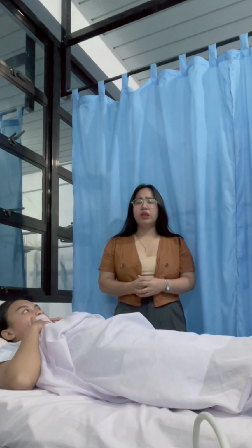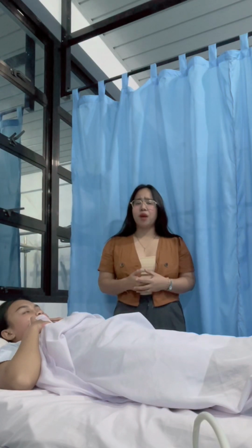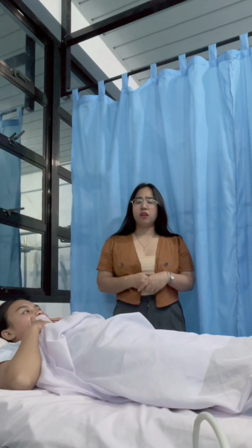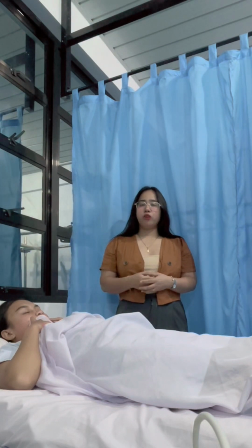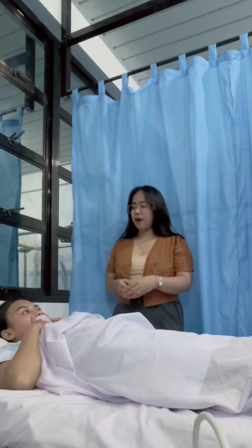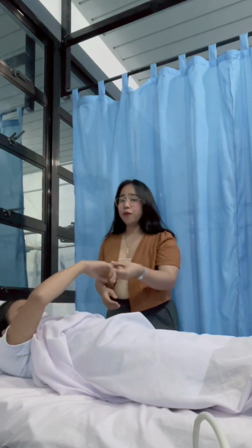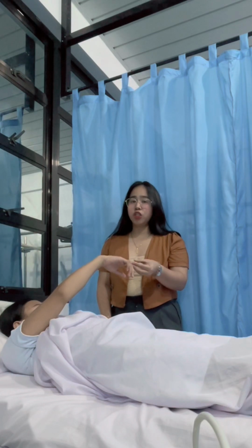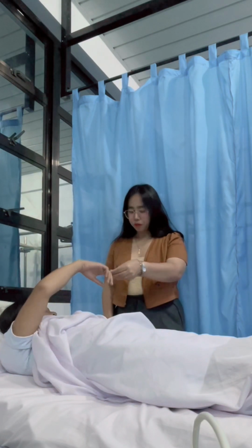But we need to make sure that the patient doesn't notice that we count his or her respiration, for her to feel comfortable and not conscious. And then make sure that the patient's nails have no nail polish to avoid a false result.